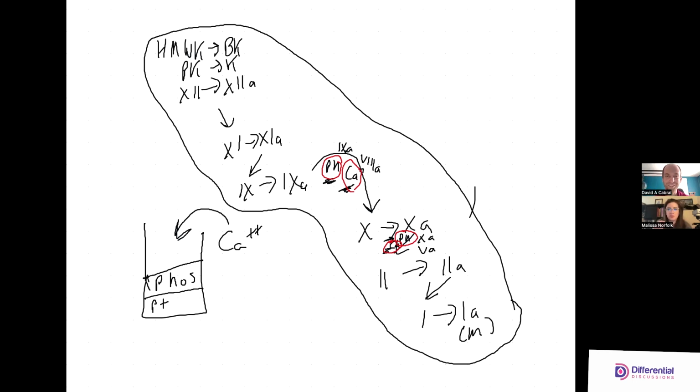Yeah, so it's measuring maximum amplitude and or maximum velocity, and both are measured for the APTT, but we're not going into either of those. So there's a lot to these, and the neat part about the optical method is you do have this clot signature curve, this data curve that's drawn out that can really help you in doing some of the interpretation. It's kind of nice.